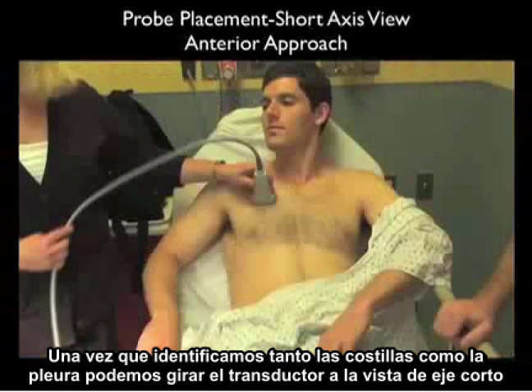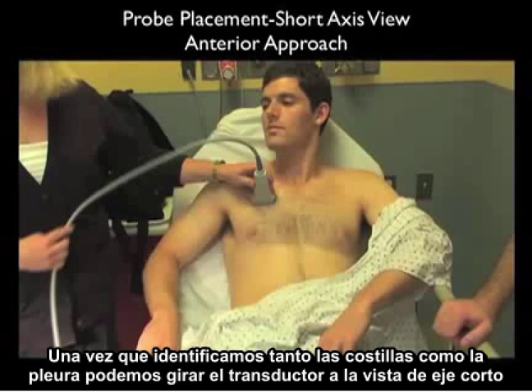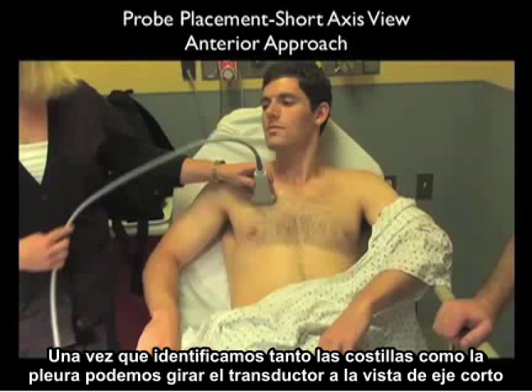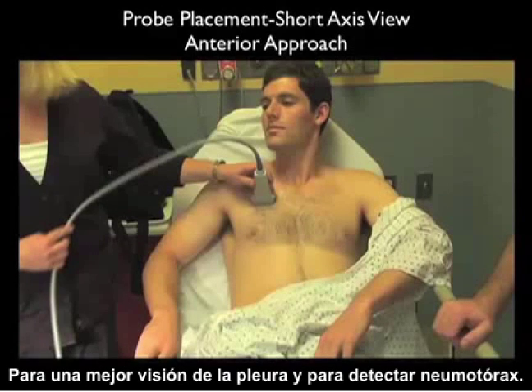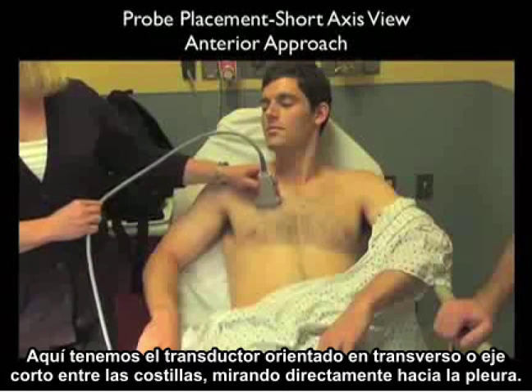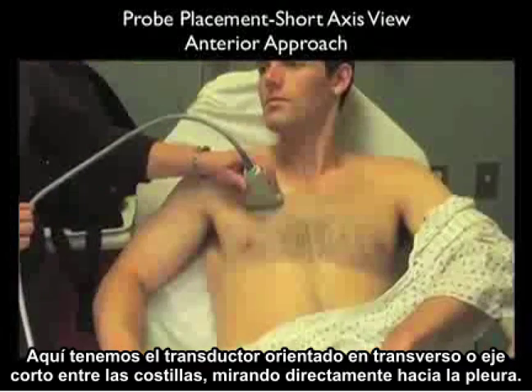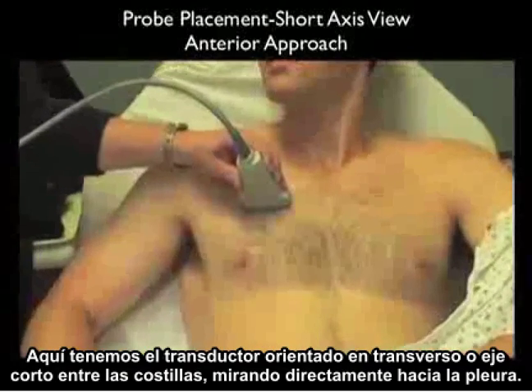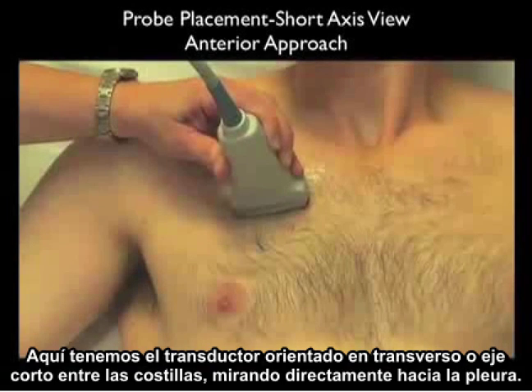Once we've identified both the ribs and the pleura, we can swivel the probe into the short axis configuration to further look at the pleura and to detect pneumothorax. Here we have the probe oriented in a transverse or short axis orientation between the ribs, looking directly down at the pleura.